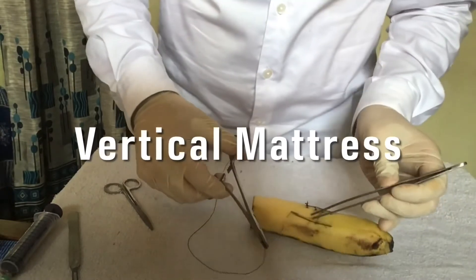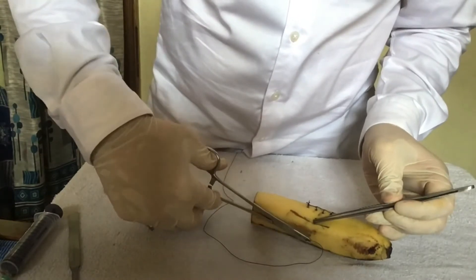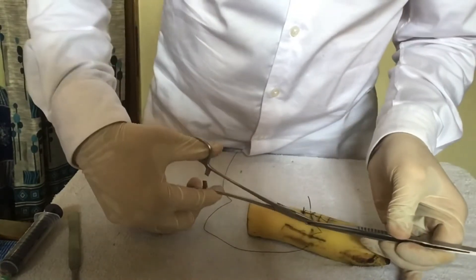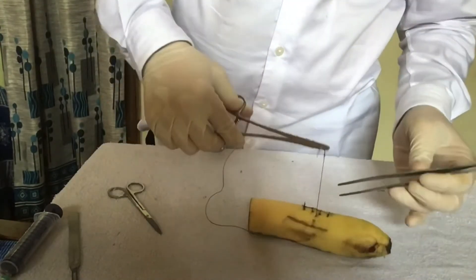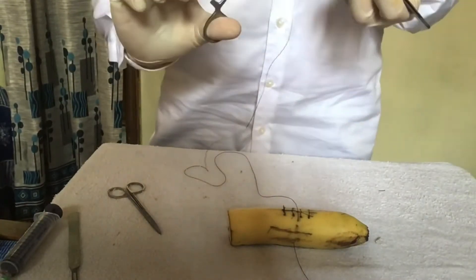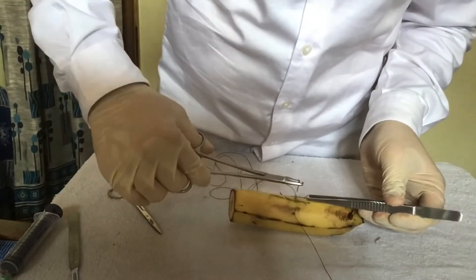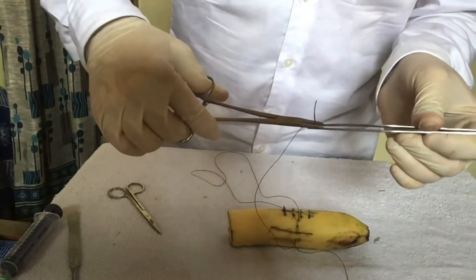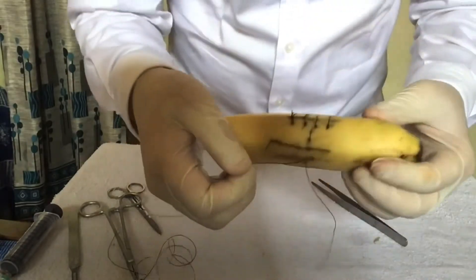In vertical mattress, the first step is the same as all other sutures but the second step is different. Make sure to put the suture inside at a larger gap from the incision than other sutures. When the first suture pass is almost done, don't tie it; rather, use a backhand needle holder grip and put it back so that the thread is leaving the site of incision from the same side.